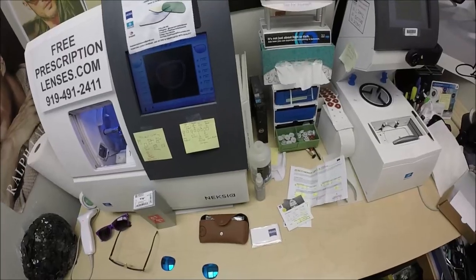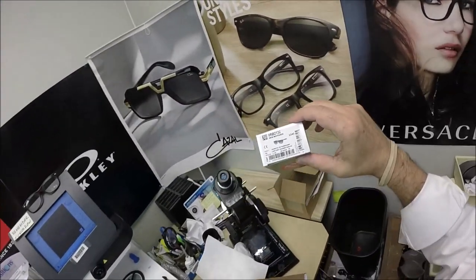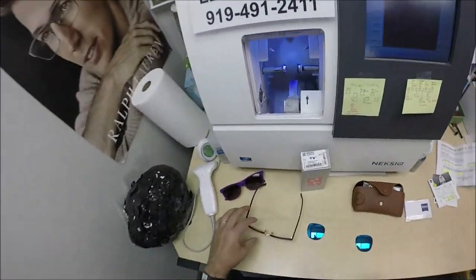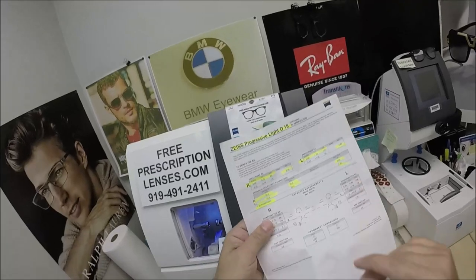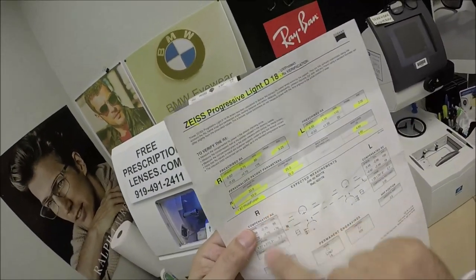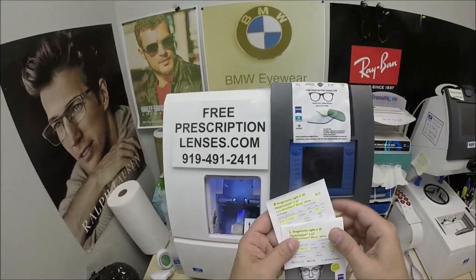Excuse me, hang on for one second. About the interruption — I'm back. My wife is here. She saw that there was a UPS delivery person out there bringing me somebody else's Ray-Bans, so I can get theirs done. So yeah, all the parameters from the digital layout from Zeiss, including the 167 Photofusion. They don't put blue, but it is the digital compensated formulas, the values that are there.